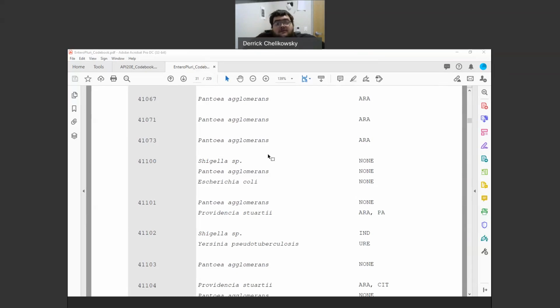Well, we think, or we do other additional tests. I don't know enough about Pantoea to know exactly what to do offhand, but I would go to my Bergey's guide and see what chemical tests it has and then tease them out between E. coli. Or just grow E. coli on EMB agar.